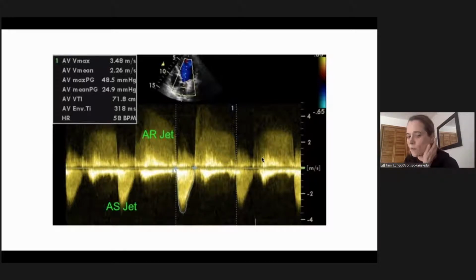I like to get both of the waveforms in one clip when I can, but then when I'm going to do the measurement, I exclude the one I don't need. I like to show the doctor both of them together, but when it's just the AS, I'll bring the baseline up and focus on that, drop the scale, make it take up the screen.